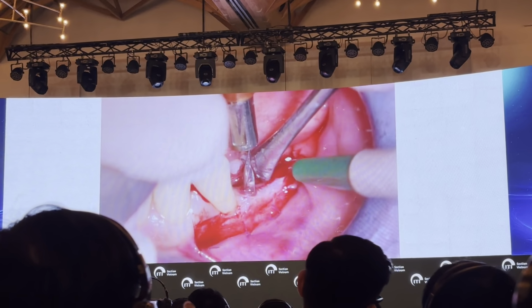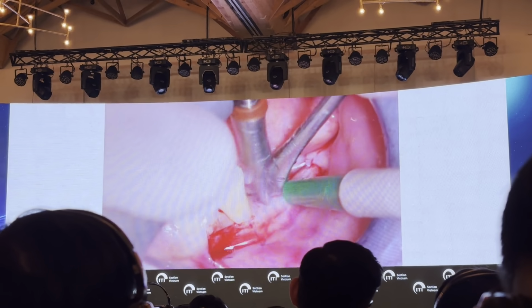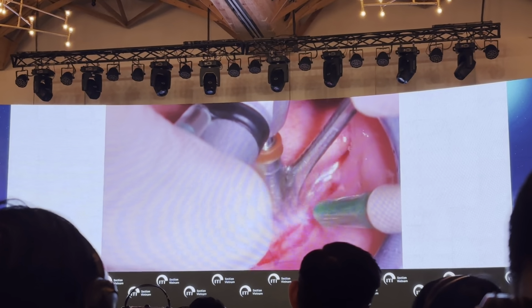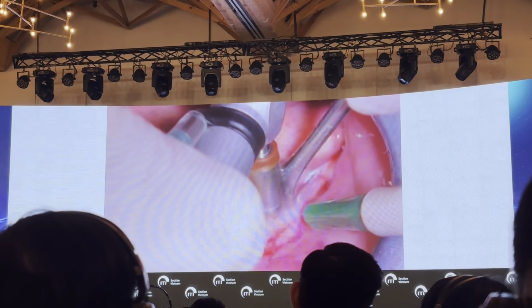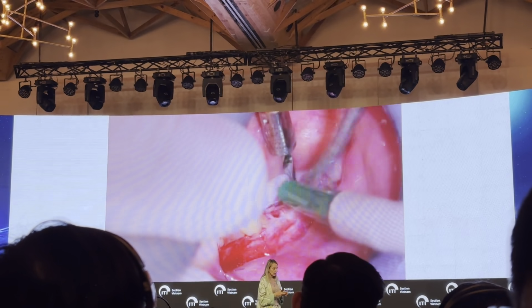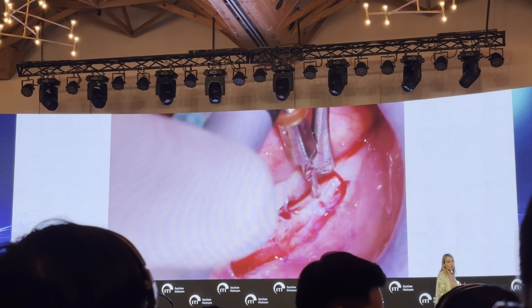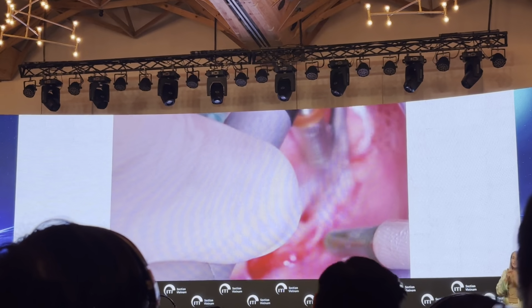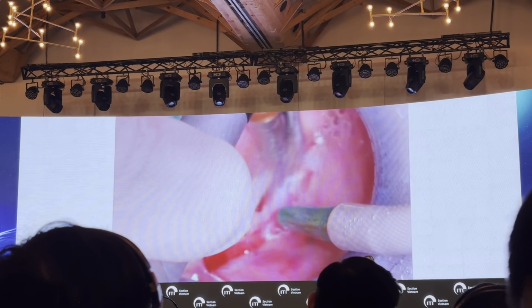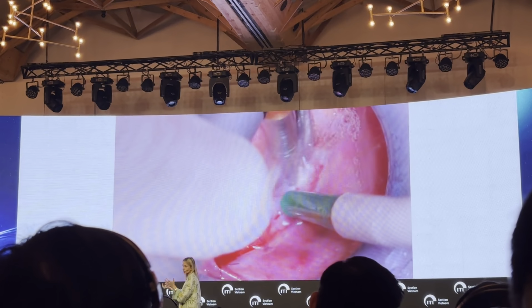in order to be sure that the implants are completely surrounded by bone. Because otherwise, if I don't have enough bone thickness and I'm not sure about the implant positioning, or I'm not sure about the maintenance of the buccal bone wall, this procedure can be dangerous, because the free gingival graft is going to survive only if it is applied above a periosteal bed, receiving the vascular supply.